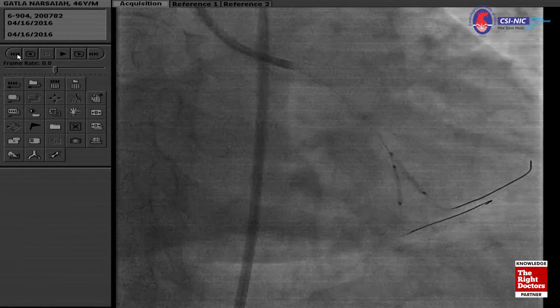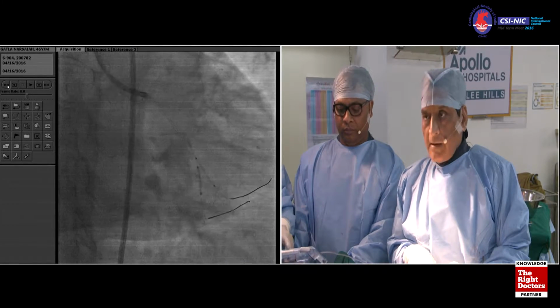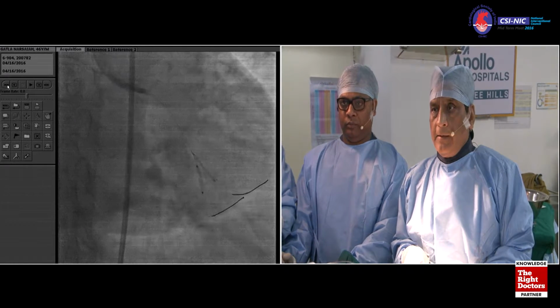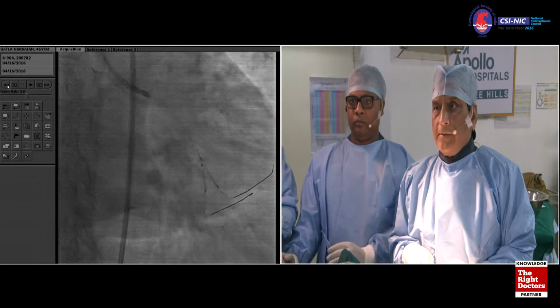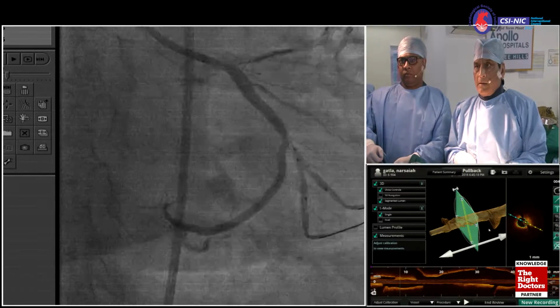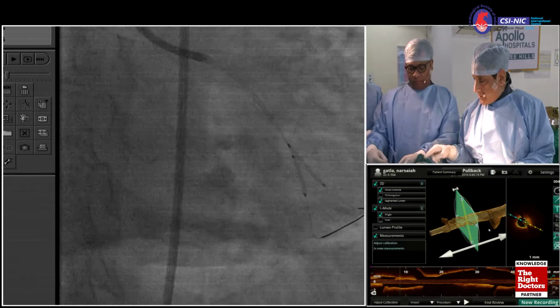Okay. Right. So I think this is the one, OM2. Which one is OM2? Okay, let's see. This is the OM2. Okay. We're going to bring it here. Let it be a few millimeter mini crush. Just give a little dye again. Okay, good. Do the OM1, your OM2.